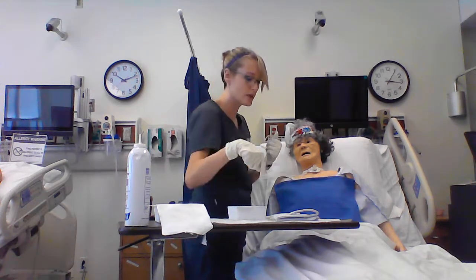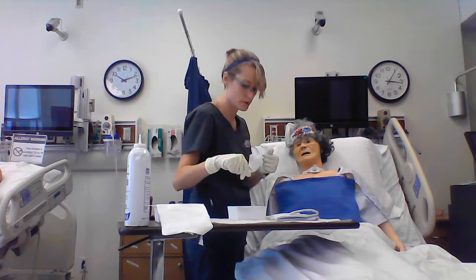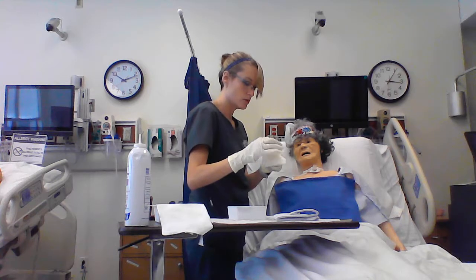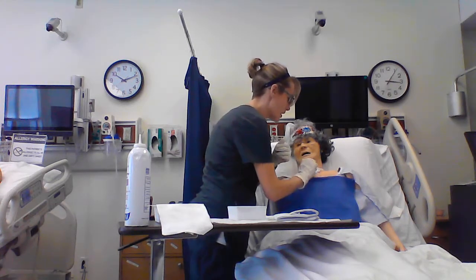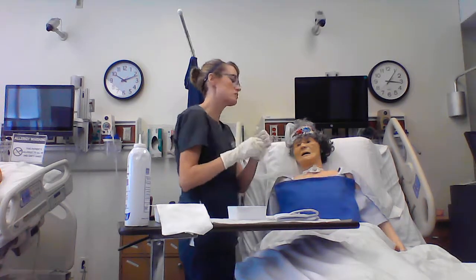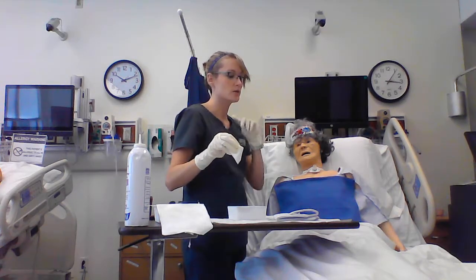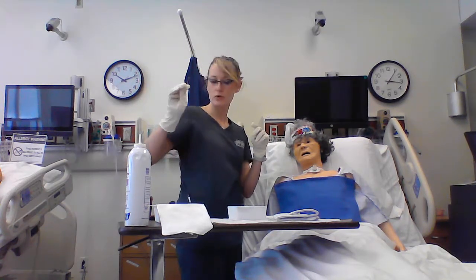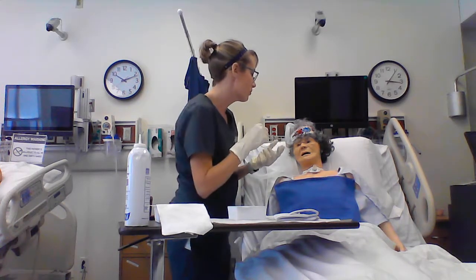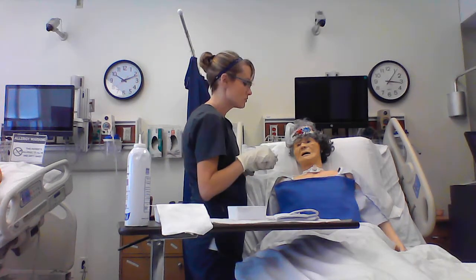You can use Q-tips for that too if you have anything that's pesky to get to, needs to be cleaned off with Q-tips. And then make sure that you dry her skin before you go on to the next step. So dry her skin off, dry the phalange off, make sure everything is good and dry before you change your trach ties out, so that you don't have an issue with your patient and skin breakdown or bacterial growth around that wet stoma. So she's good and dry.